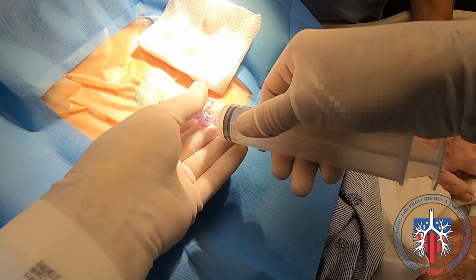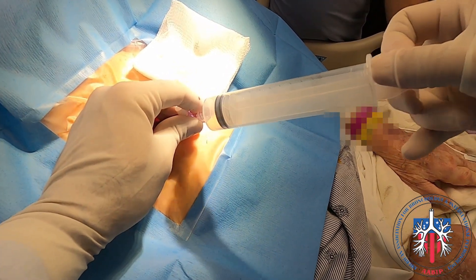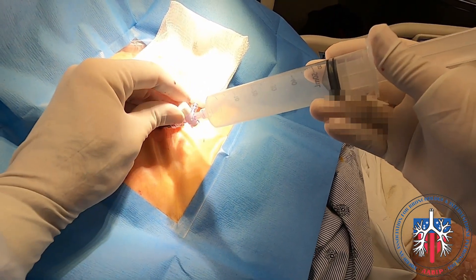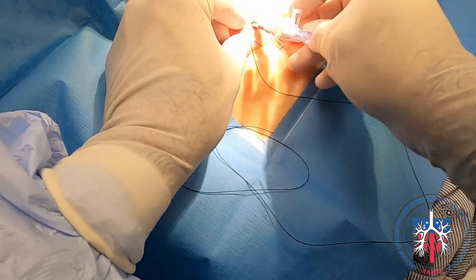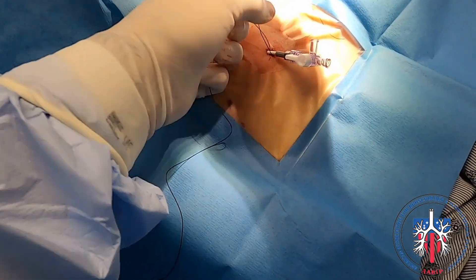We aspirate air from the pleural cavity using a 60 ml syringe. Then, to prevent dislodgement, we proceed to secure the drain to the chest wall with a simple suture.